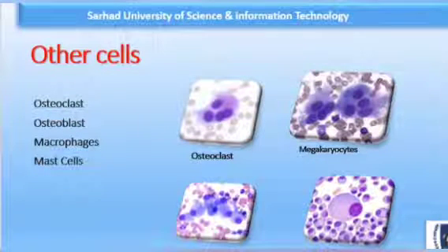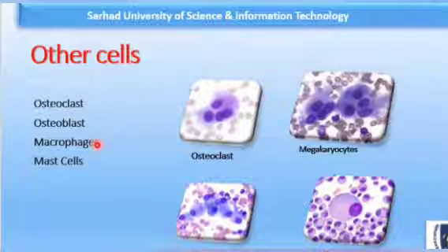At this stage, some normal and abnormal large cells may also be seen, like osteoblasts, macrophages, mast cells, and endothelial cells. They are normally seen in small numbers, but their number may be increased in certain disease states. Osteoclasts should not be confused with megakaryocytes.